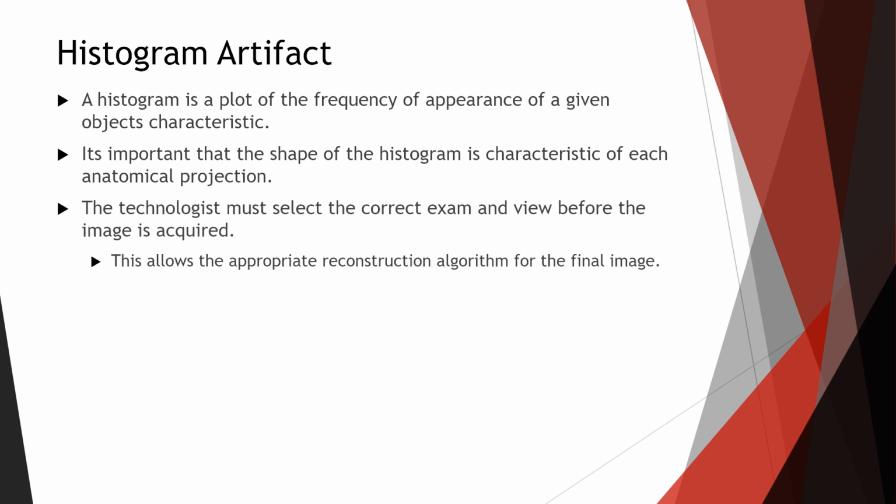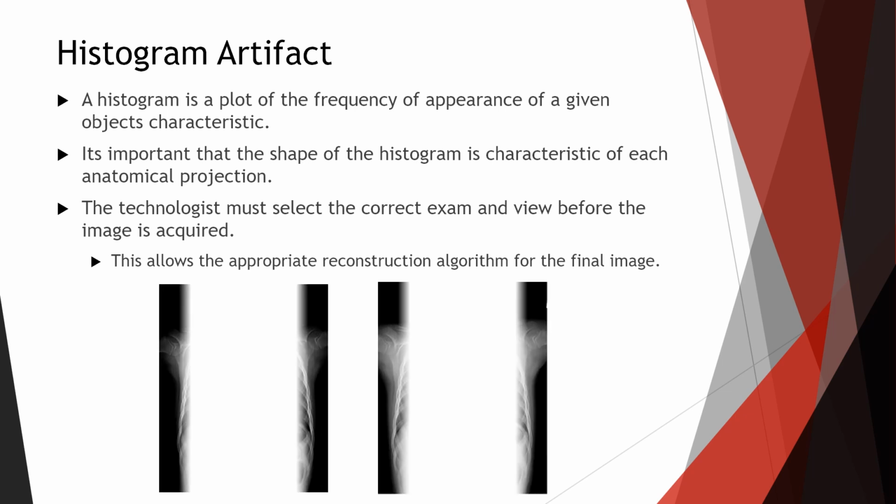The technologist must select the correct exam and view before the image is acquired, because each one may be different, even within the same exam or the same body part. This allows the appropriate reconstruction algorithm for the final image.